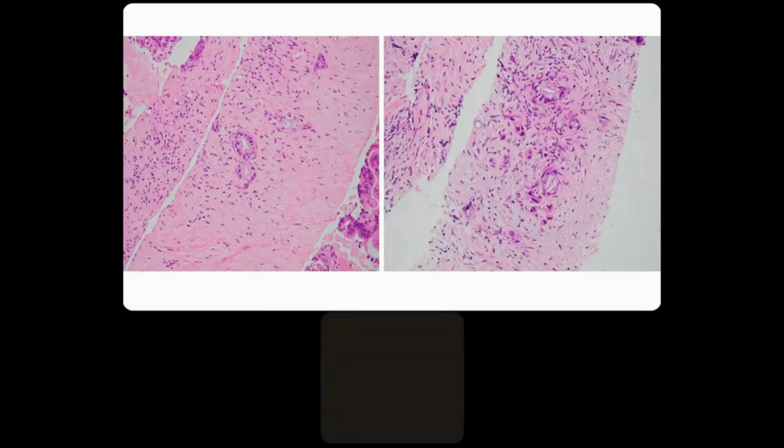And if you're lucky in some cases, you'll see that the nuclear features over and above what I've described as nucleomegaly, hyperchromasia, loss of stratification, mitotic figures, nucleoli, you may see an irregular nuclear outline imparting this raisinoid appearance to the nuclei. Again, a very key feature for pancreatic adenocarcinoma. Okay, so better differentiated ducts here. But again, in isolation, could this be chronic pancreatitis with widespread atrophy of the acinar tissue? In isolation, those two, probably not, because you've got hyperchromasia, nucleomegaly, irregularity of the shape. These two ducts here are pretty diagnostic, in my opinion.